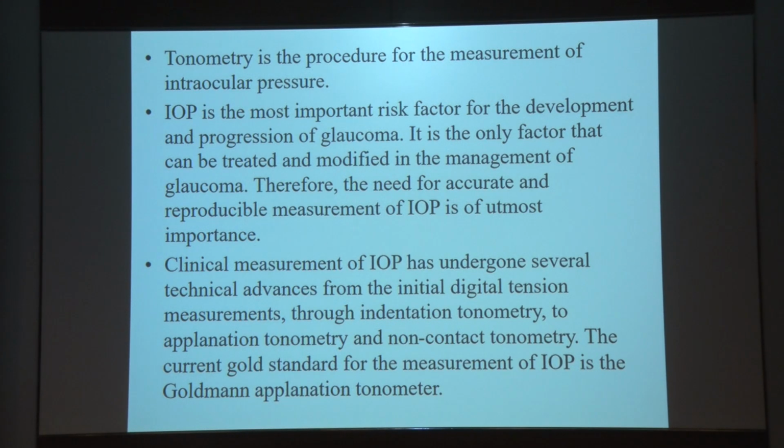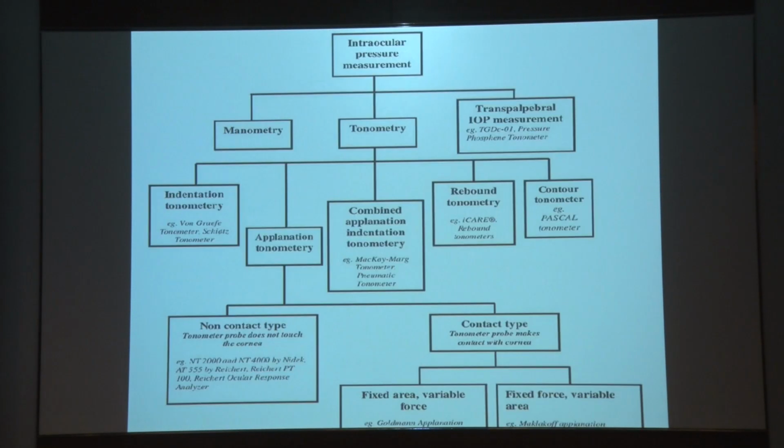Clinical measurement of IOP has undergone several technical advances, from the initial digital tension measurements through indentation tonometry to applanation tonometry and now to non-contact tonometry. The current gold standard still remains the Goldmann applanation tonometer.